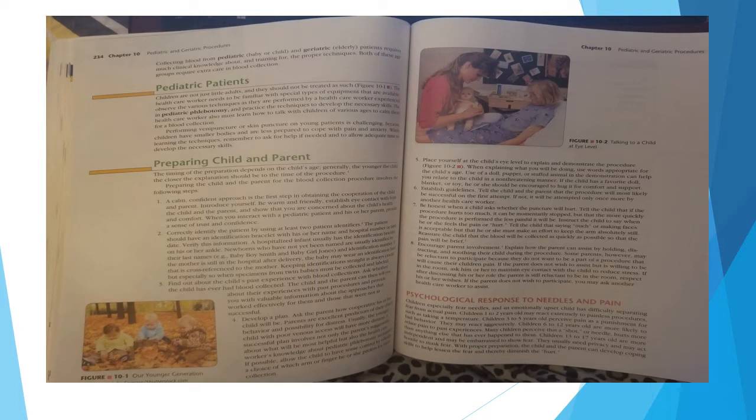Collecting blood from pediatric (baby or child) and geriatric (elderly) patients requires much clinical knowledge about and training for the proper techniques. Both of these age groups require extra care in blood collection. Pediatric patients. Children are not just little adults, and they should not be treated as such. The healthcare worker needs to be familiar with special types of equipment that are available.